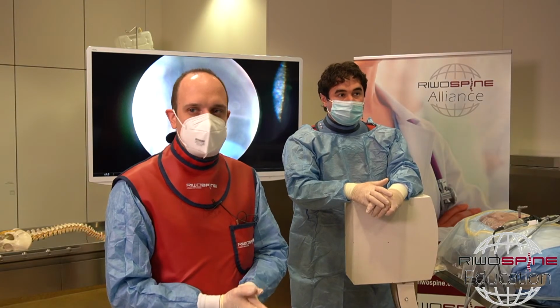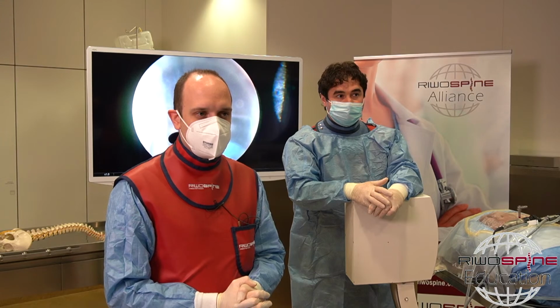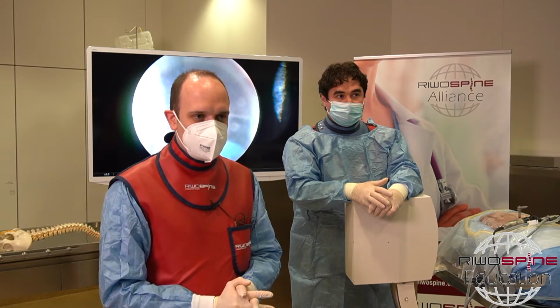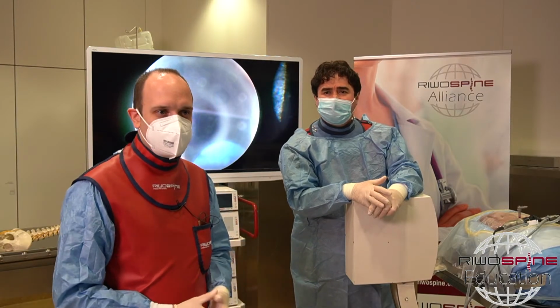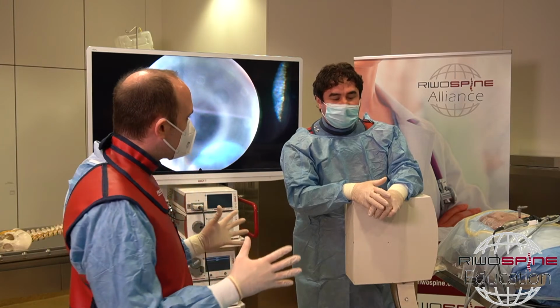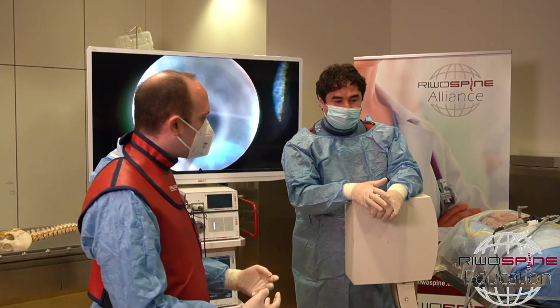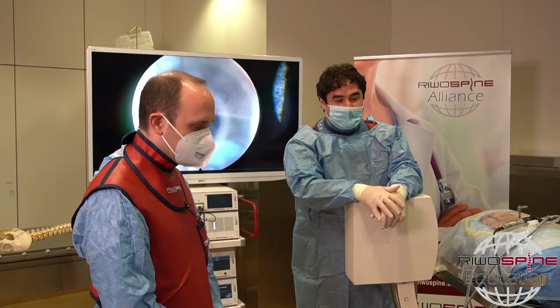Do we have any more questions? Do you prefer to use the bone punch instead of the Kerrison for expanding the opening of the flavum? So again, I didn't get the question. Do you prefer the bone punch instead of the Kerrison punch? Bone punch means the tube punch, yeah.